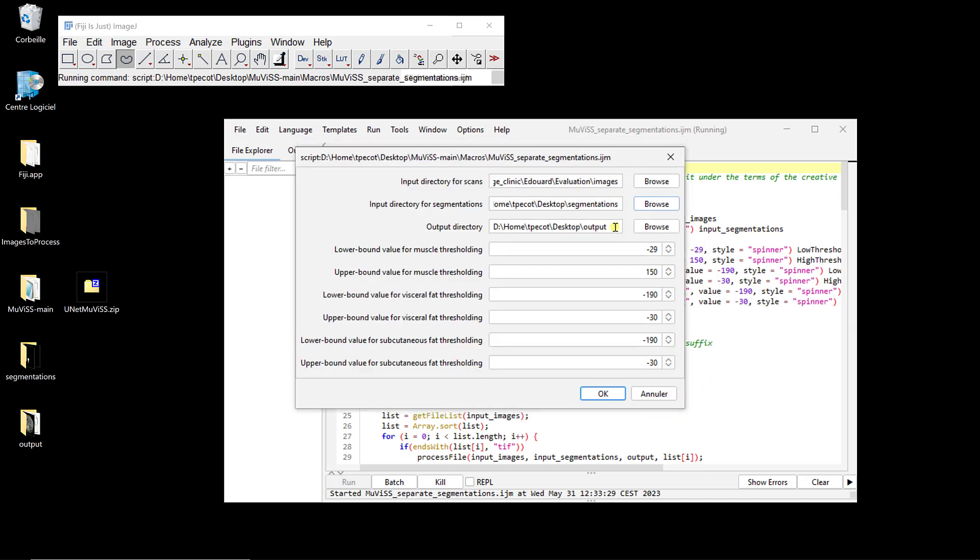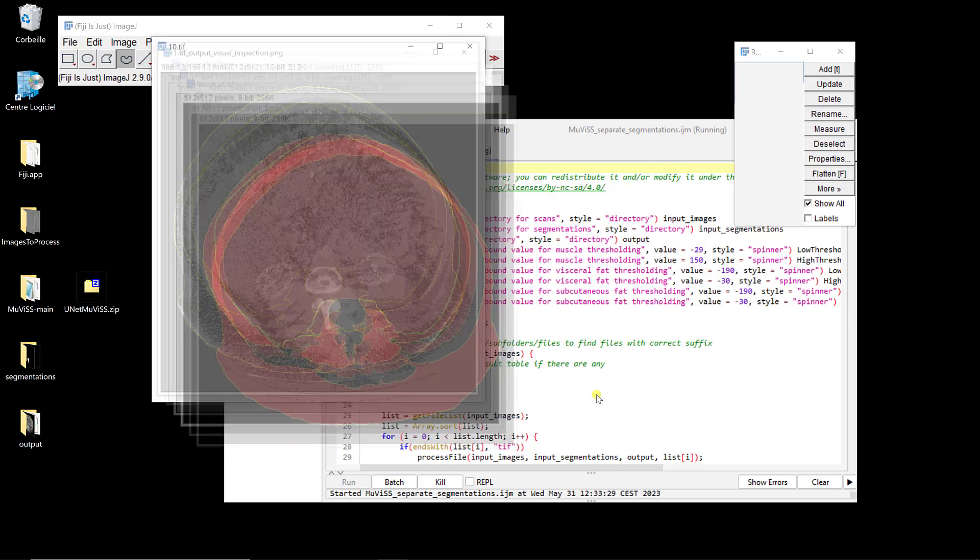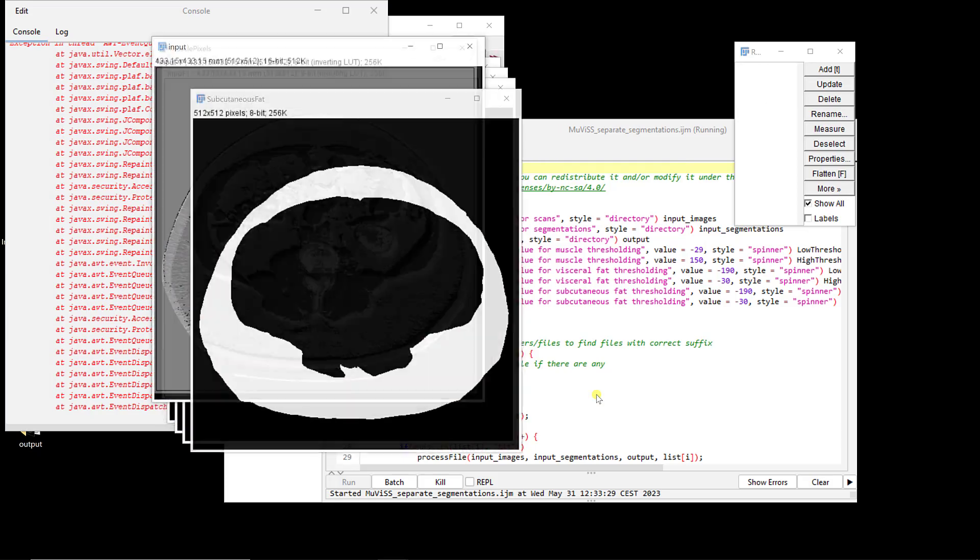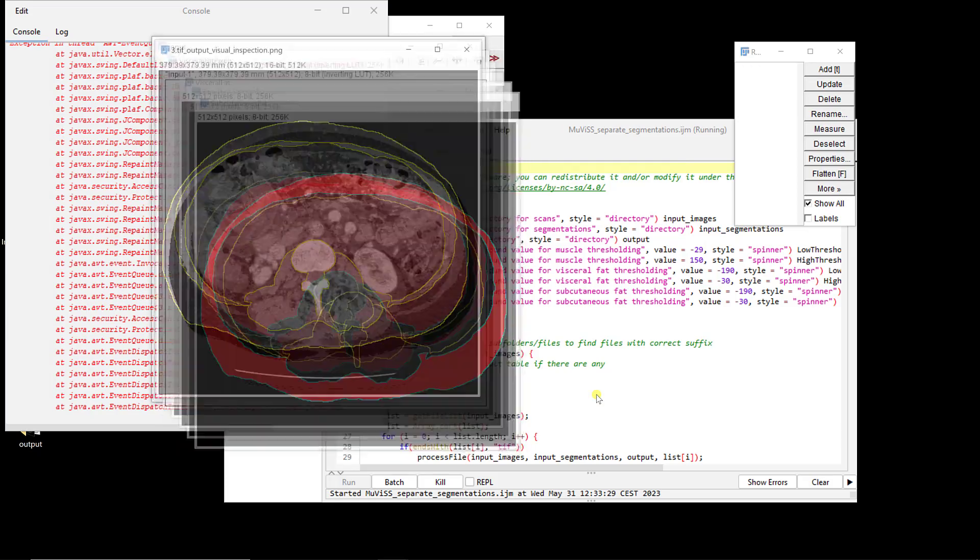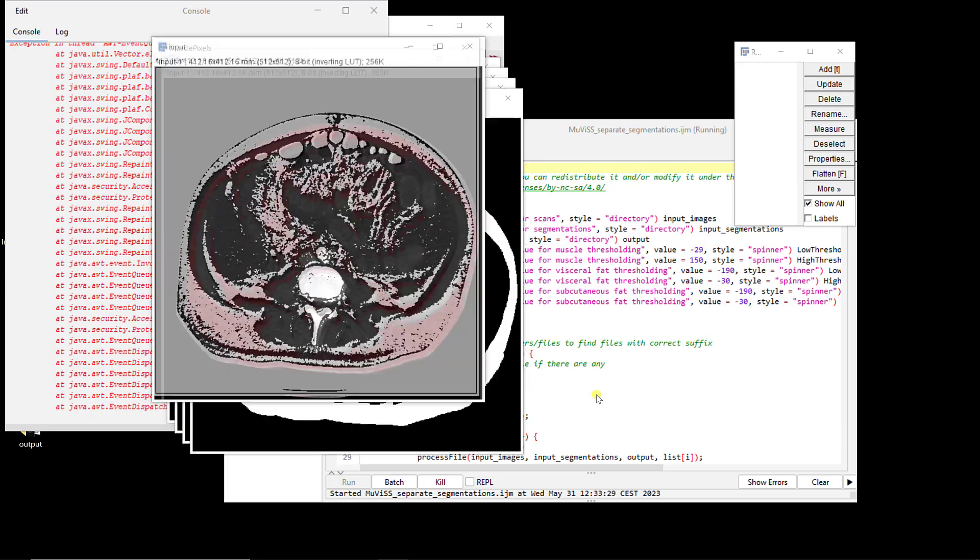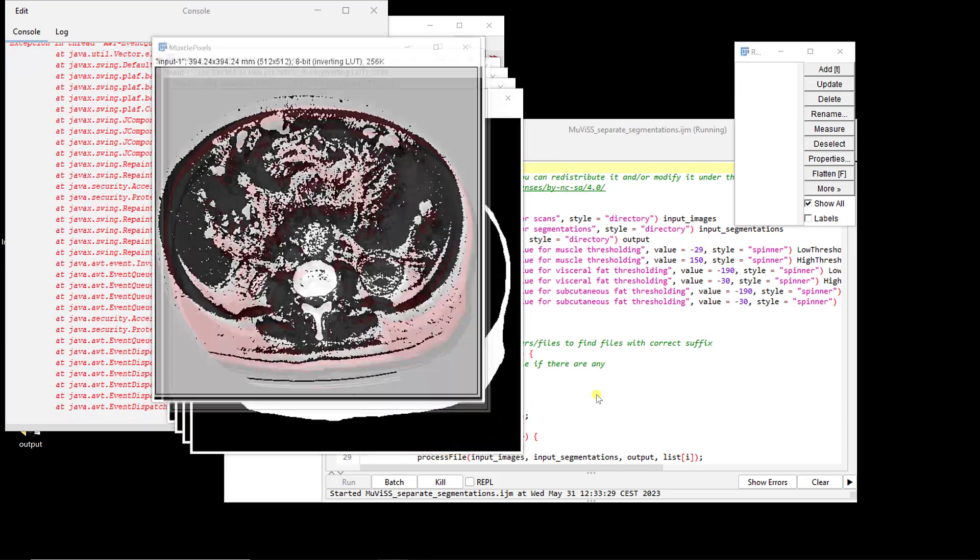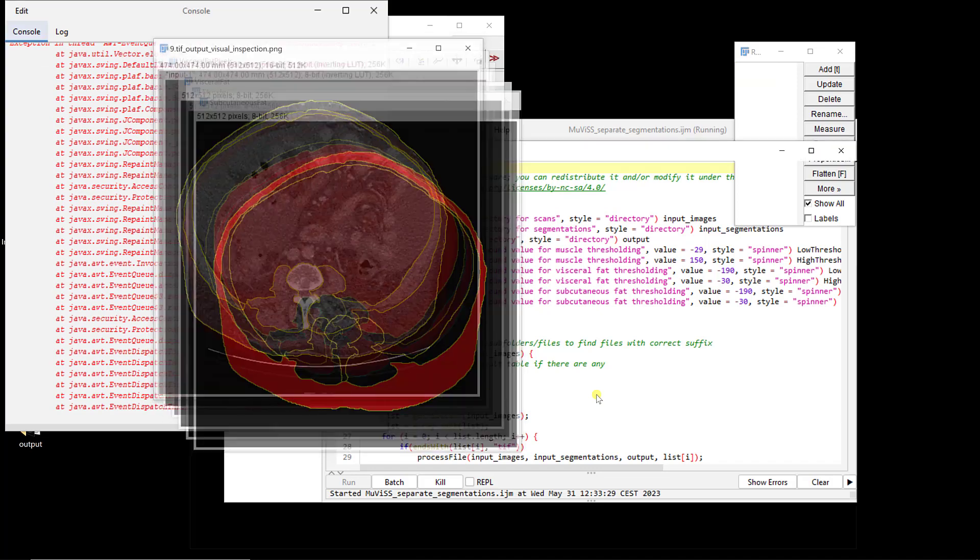And I'm going to use output. And then you have the intensities, the range of intensities that you can still define for muscle, for visceral fat or subcutaneous fat. So again, we use the same range of intensities for visceral and subcutaneous fat. And then you can just run the macro. And so it's faster than before because obviously we don't have to run the model. So you just have the post processing and computation. And now it's done.